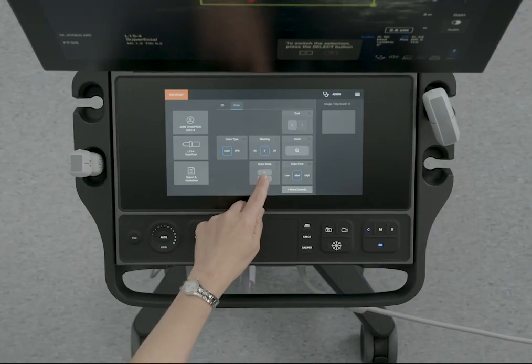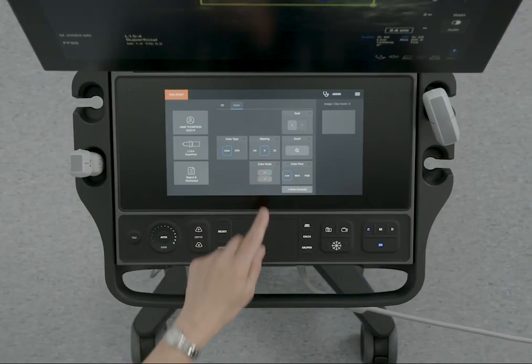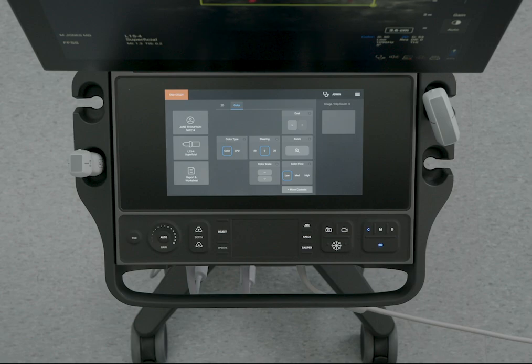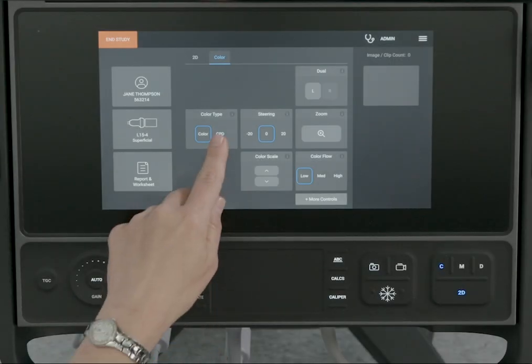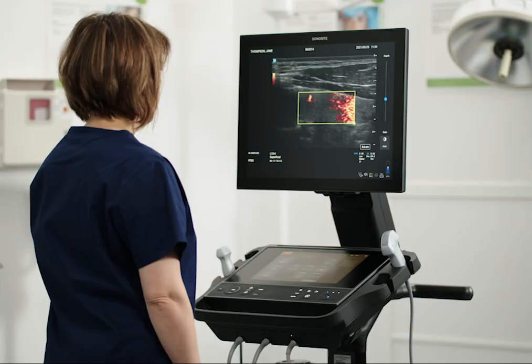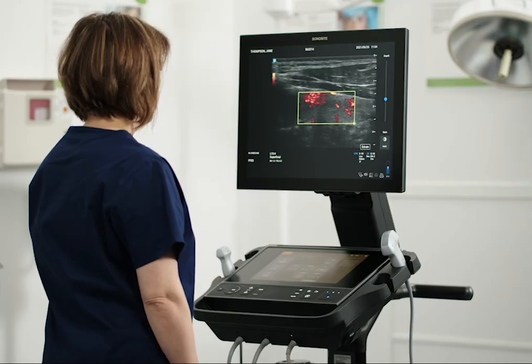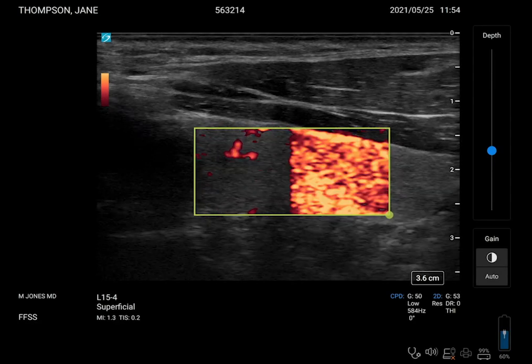You may need to tap the More Control button to find the control. To change to Color Power Doppler, tap CPD on the Color Type control. You can use CPD to detect very low levels of blood flow.